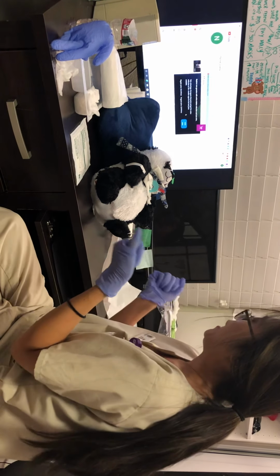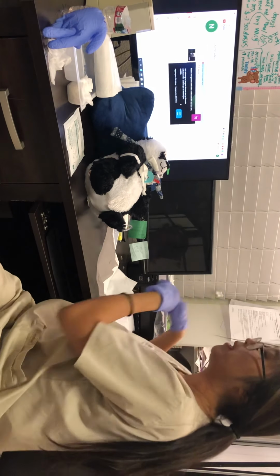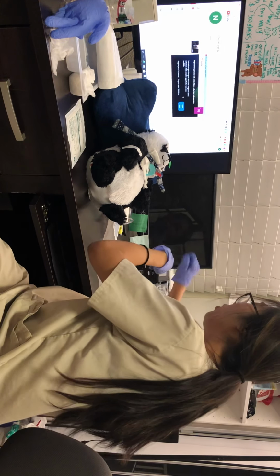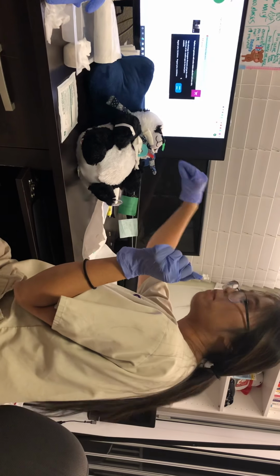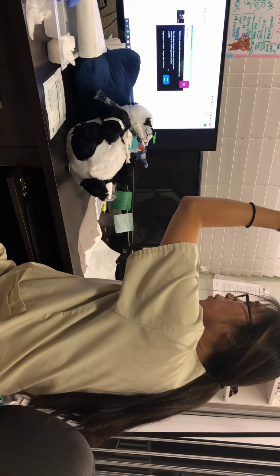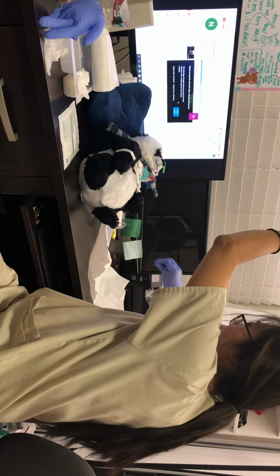Yes. All right, so now I'm going to set up my equipment. In this case, I would open my equipment. I would perform hand hygiene again. Then I would open my equipment, making sure that this part stays sterile, the part that enters into the patient. The part that connects to the oxygen would go with the left hand, because your right dominant hand will stay sterile.